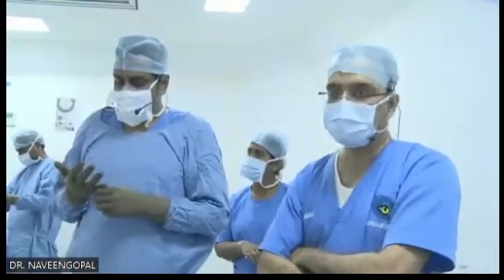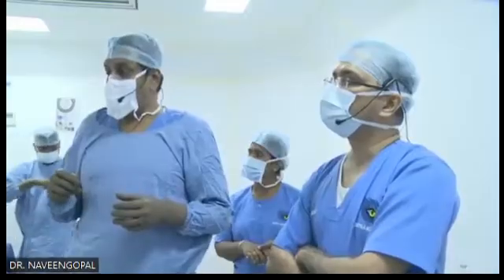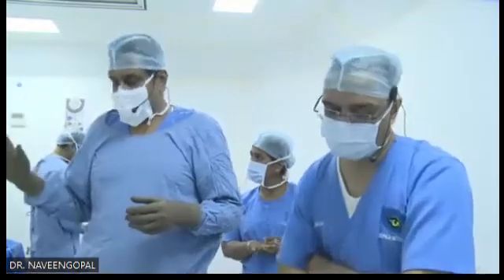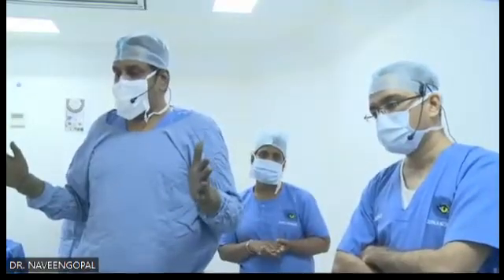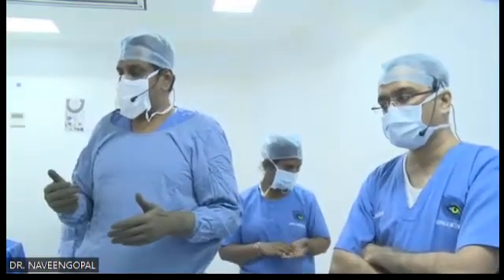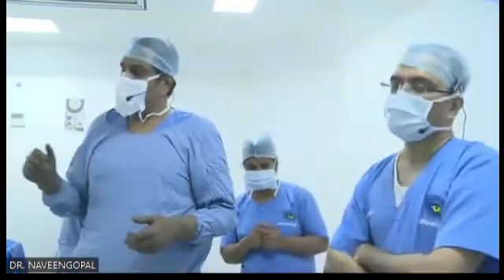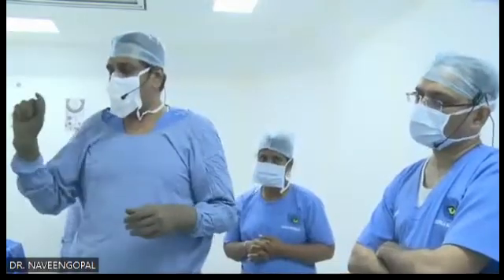You told that the patient had pre-op astigmatism of 2 diopters. No, not 2. This patient had 0.25. Oh, okay, so it was my hearing mistake. Anything above -1, I prefer toric. Up to -1, I can do OCCI and manage with incision. OCCI is opposite clear corneal incision. I can do a 2.8 and 2.8 incision on the opposite side along the steep axis. I can manage up to -1. Beyond -1, I can't manage. Toric lens is the best choice.